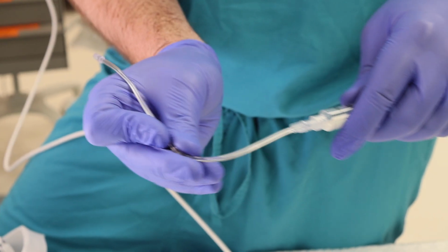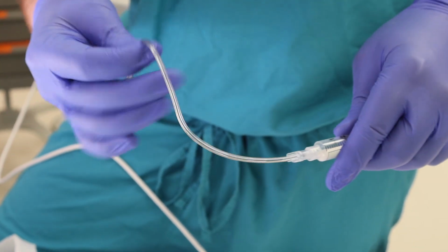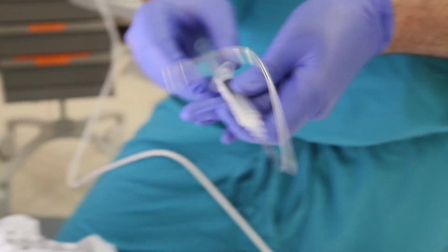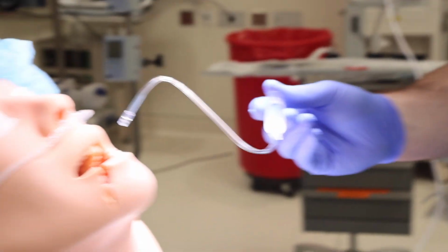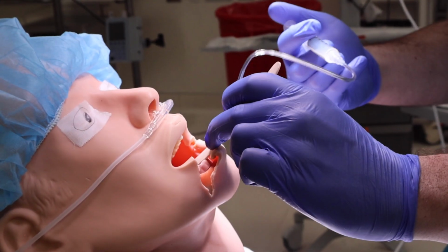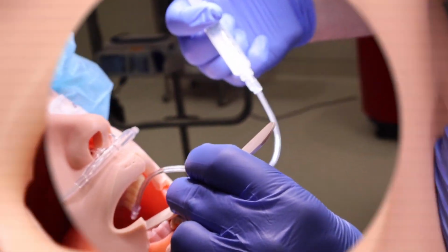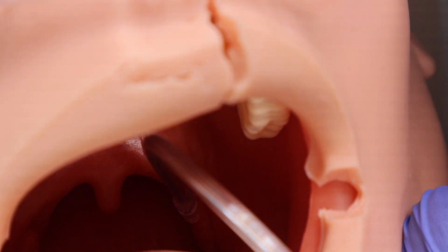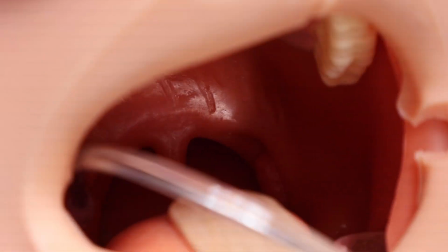At 10 minutes before intubation, apply 2% lidocaine via the atomizer to the tonsils or pillars to topicalize the glossopharyngeal nerve, as well as the hypopharynx to topicalize some of the area covered by the superior laryngeal nerve. In total, use 3 to 5 milliliters per side. Use a tongue blade or laryngoscope blade for visualization, and carefully track the total lidocaine dose.